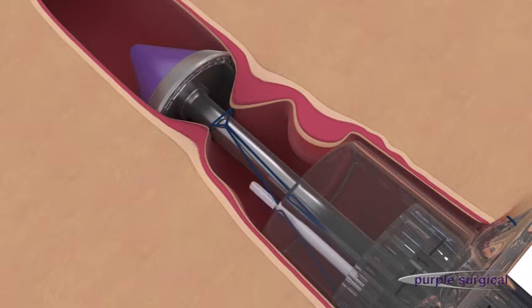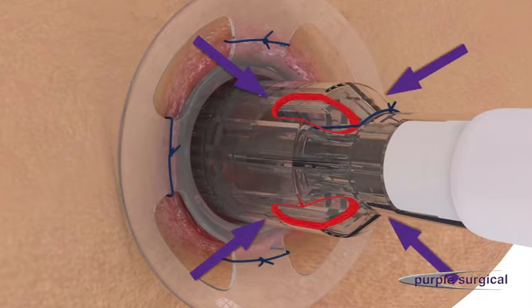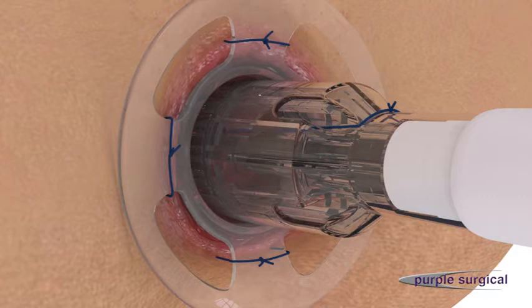Using the suture threader, pull the suture through the suture threading ports located around the transparent cartridge on the ultimate hemorrhoidal circular stapler. The suture ends are then knotted externally or held in place by a clamp.